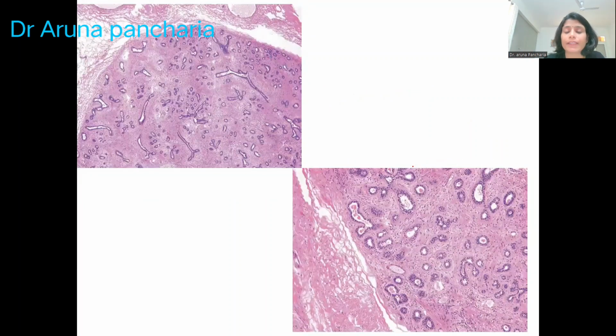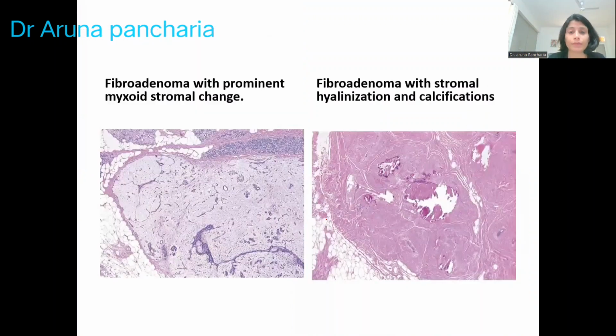Now the other one is the pericanalicular pattern, and here the gland remains round in shape, because the stromal overgrowth is in such a way that it encircles the gland. So in low power, it looks like rounded glands or rounded ducts. So this is the pericanalicular pattern, and this is the pseudo capsule, and it is formed by the surrounding breast tissue.